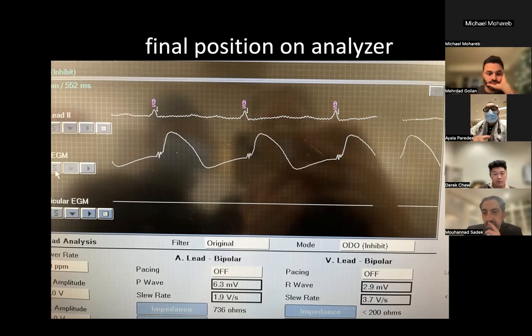I think I'll just tell you, interesting point: we have an analyzer where it's always way out. It's a software analyzer problem. That's not where it's sensing, because I have patients where I'm clearly pacing the His, and yet, you know, so this is just not really where it's sensing. The two line up.